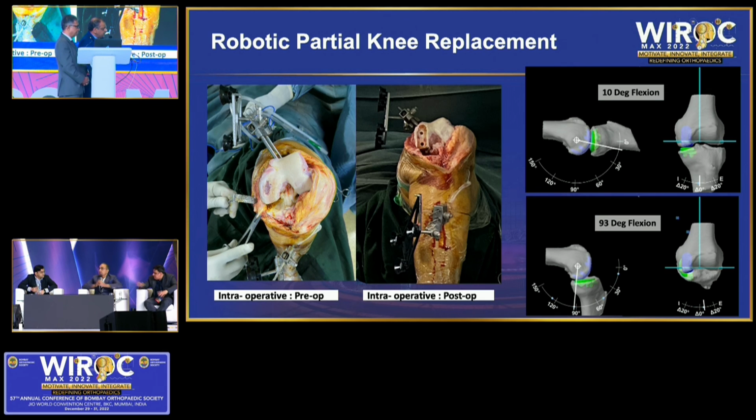Dr. Jhurani? Yeah, so most of the knees are early arthritis and they have the natural physiological recurvatum, 2, 3, 4, 5 degrees of natural recurvatum. Now you need to put that back at least 1 or 2 degrees. So you can't give FFD. And most of the planning and the adjustment is done on the femur side. So you can anteriorize or posteriorize the femur, proximalize or distalize the femur and take minimum of the tibia. And don't use any jigs, that prevents any stress risers on the tibia, any saw which prevents any stress riser. So all great advantages for uni.